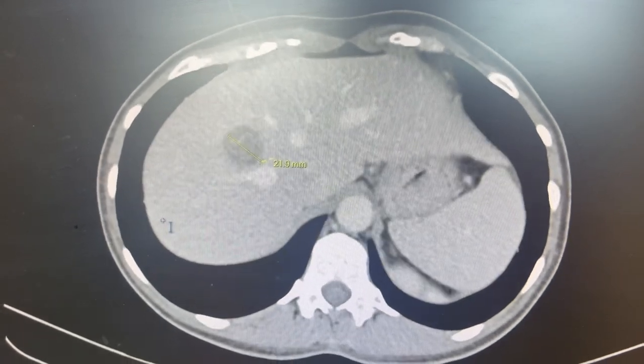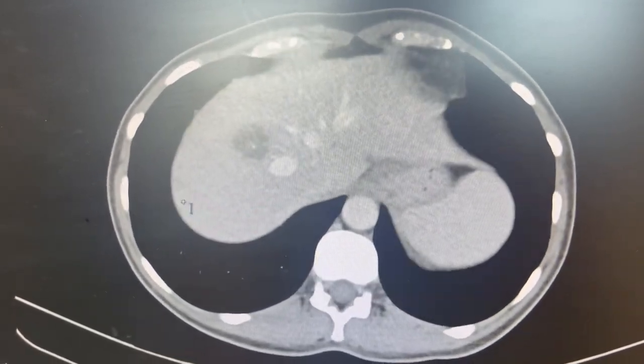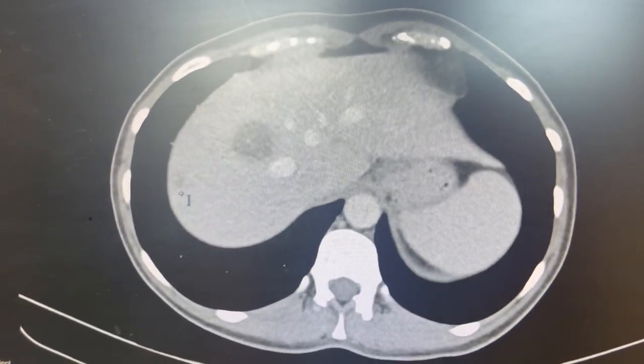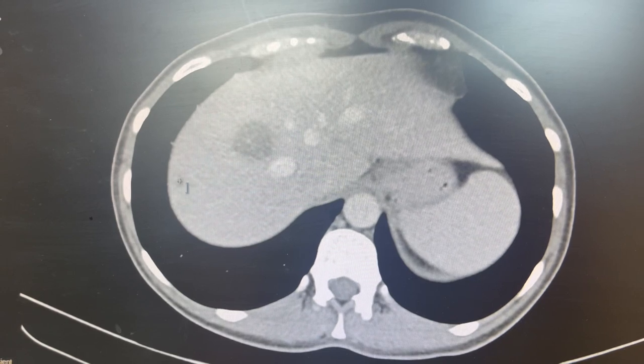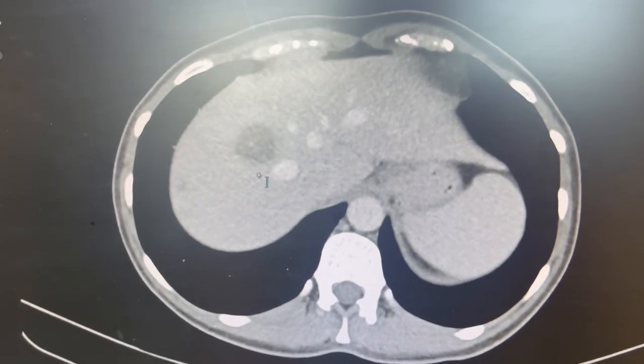I consented the patient for a robotic right hepatectomy and wedge resection of the left lateral segment tumor.